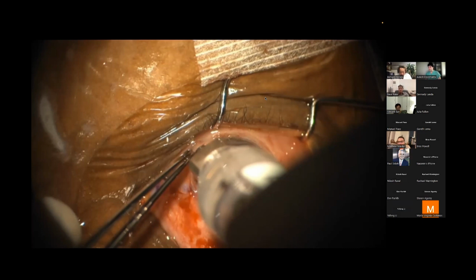You need to displace it with viscoelastic. You need to keep it, because if you try to remove it after, the air will come again. You need to do it during the surgery, then use some viscoelastic. Yeah, but again, 3-4 days after, the viscoelastic should be out of the eye, right? Yeah. Okay. Some glaucoma drops in anyway, and give some Diamox at the end of the case, and generally the pressure is not a problem.